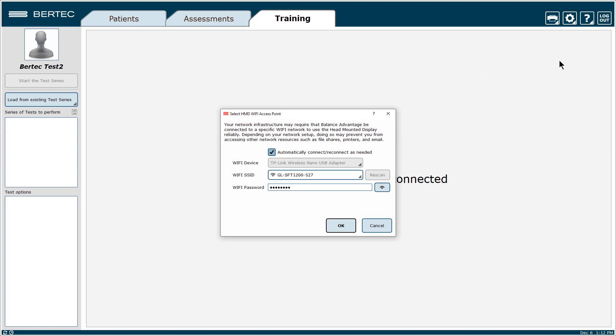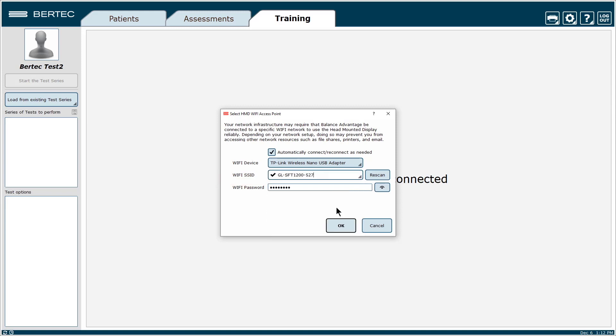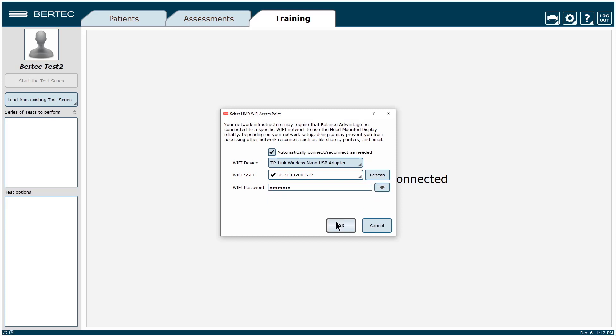In the pop-up window, make sure the Wi-Fi device is TP-Link. Select the Wi-Fi SSID that corresponds to your router and then type in Goodlife for password. Then press OK.